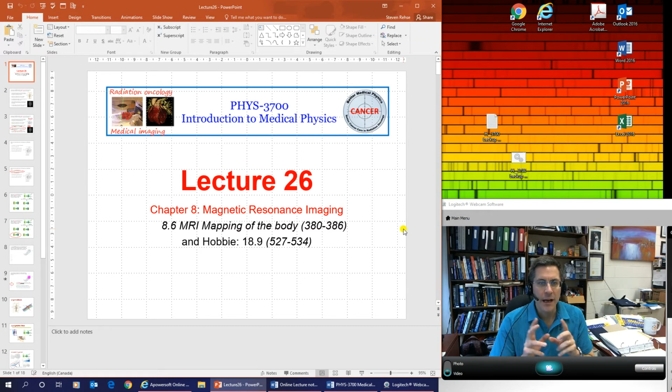lecture 25, we were talking about how contrast is obtained. I showed you all those pictures about how some tissues are light and some tissues are dark, depending on whether you use T1 or T2 weighting, and how the different tissues could then be resolved. But now we have to get into the really difficult question of how are you going to locate those tissues within the body? What about the spatial resolution?